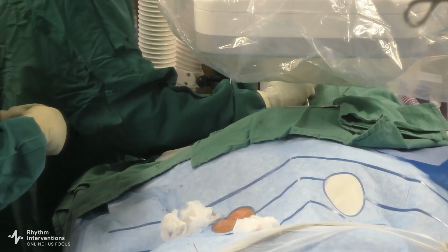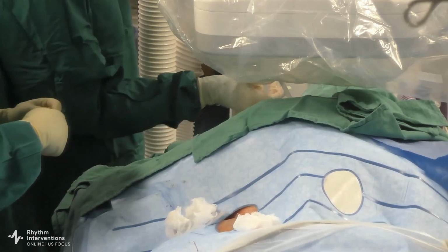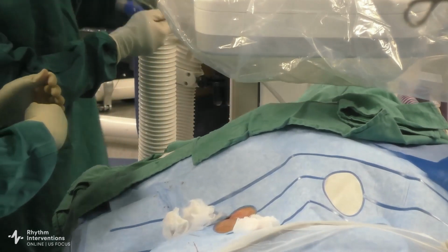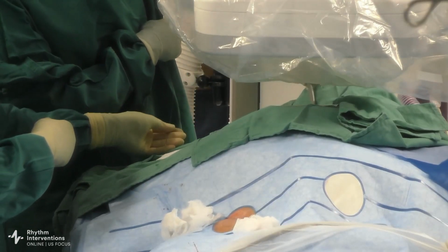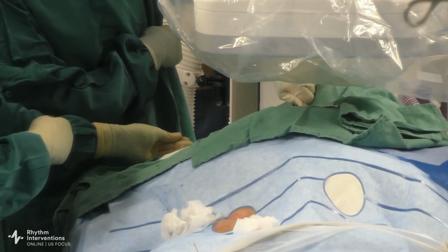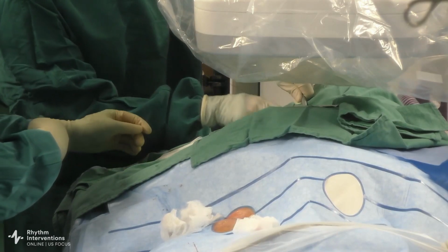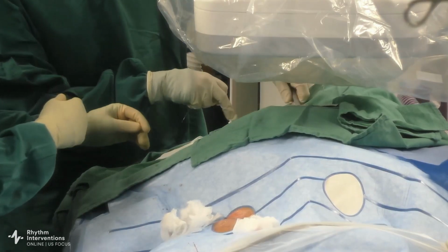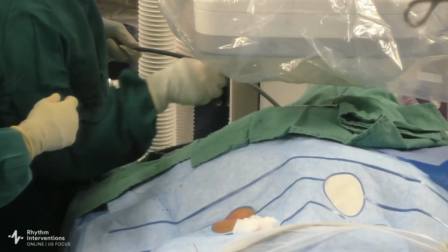Yeah, it's tough here. Okay, think. I don't know if it's the neck per se, or more wet, make it more wet. All right, give me some wet.